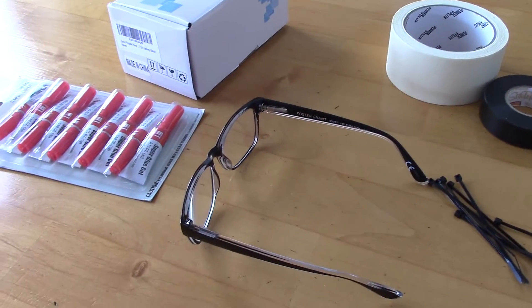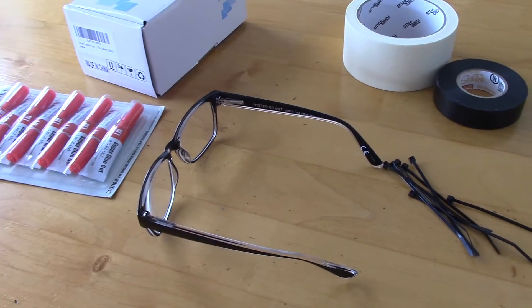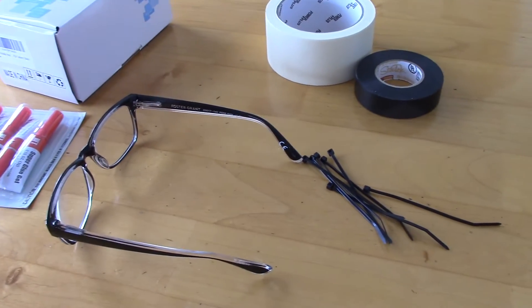Hello YouTube! Today we're going to make a very easy do-it-yourself surgical operating headlight.